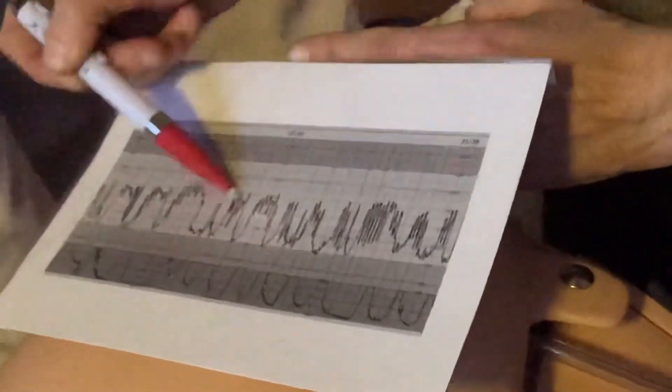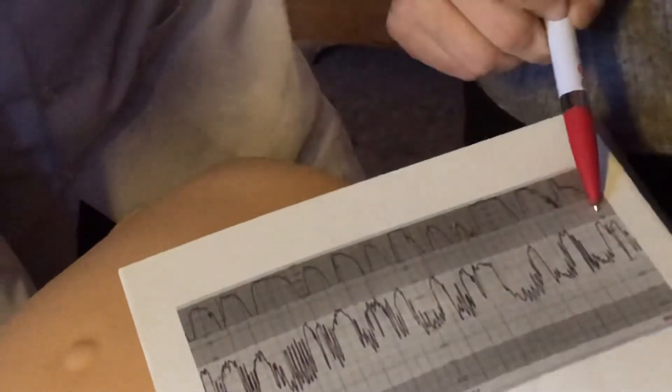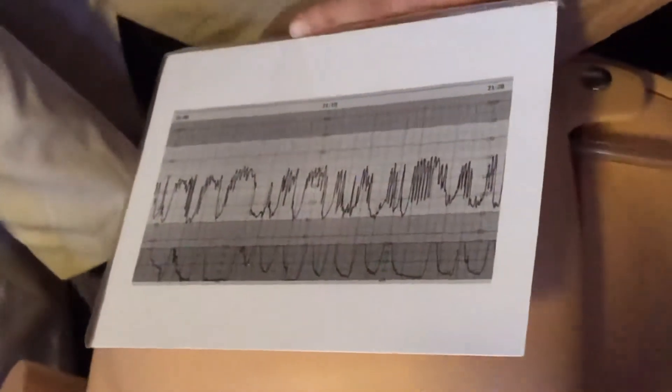Again, uterine contractions. And guys, the height of the wave is more than 30 heartbeats per minute — between 140 and 80, so 60 heartbeats. This type is called saltatory rhythm. Saltatory rhythm most often is caused by intrauterine compression of the umbilical cord. This is fetal distress. My patient needs emergency delivery.